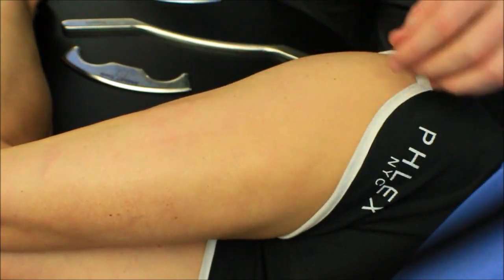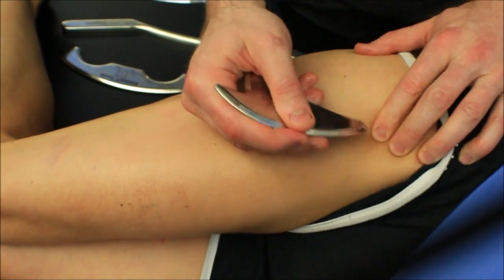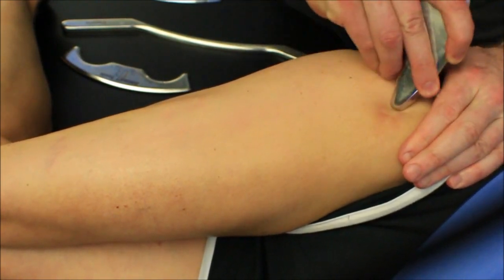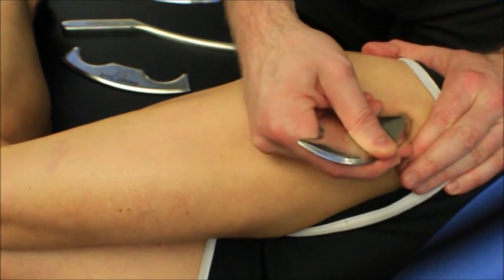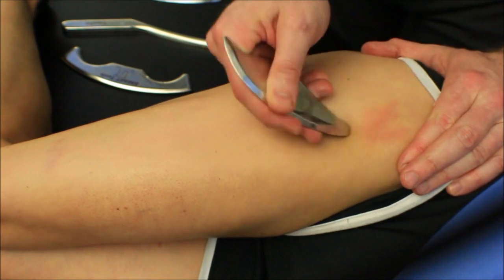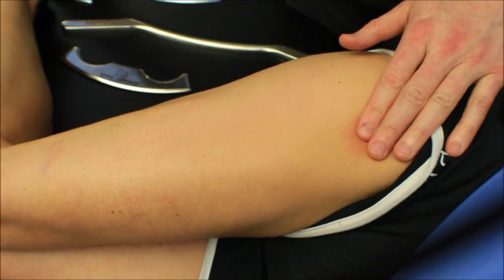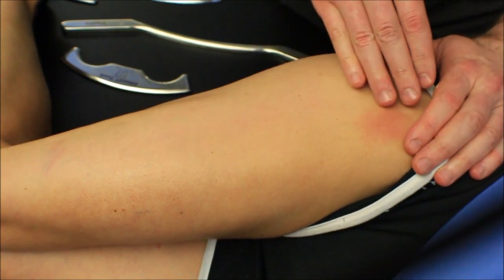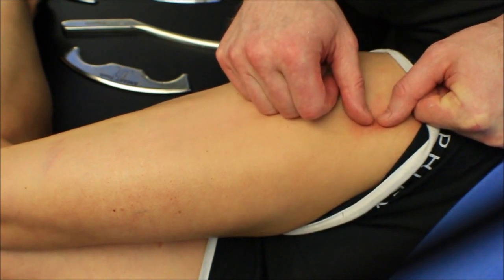Of course I could go after trigger points next. Let's say I felt a trigger point up in her TFL, right in there — I can try to break that up as much as I can. We're making an assumption that maybe around trigger points we get a little extra collagen laid down, a little of that disorderly matrix, that binding tissue. I've noticed there's better carryover for trigger points when I add this, and you can notice how red that got that quickly. There's a better carryover when I follow up my static manual release techniques with some instrument assisted soft tissue mobilization.